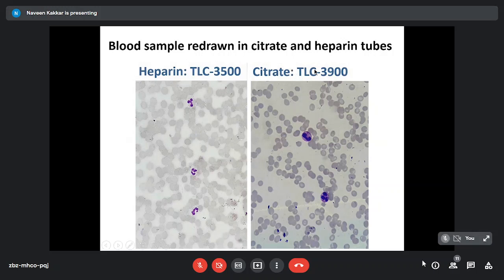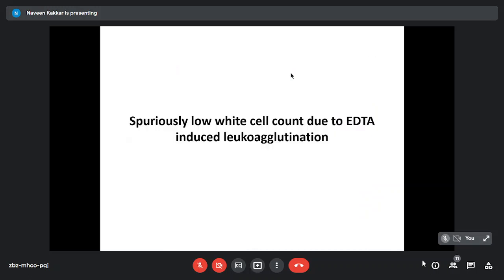The TLC was good in citrate. The initial one was 1900, so it's almost doubled. That means it still had some phenomena of hypersplenism, but at least the TLC is higher now, much higher. So that's a spuriously low white cell count due to EDTA-induced leukoagglutination. I hope you remember now what I said on the expanded form: error, dilemma, and trouble-causing anticoagulant. You had so many examples today itself.